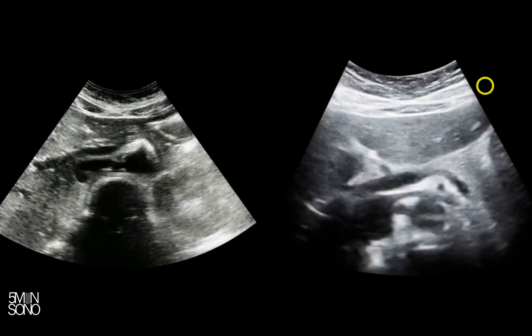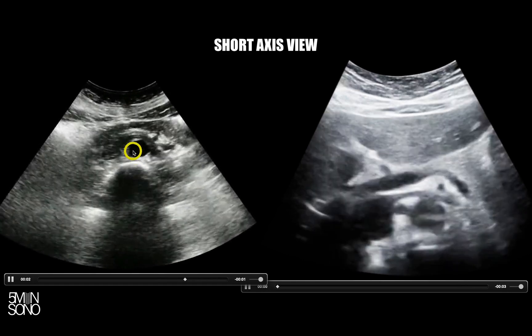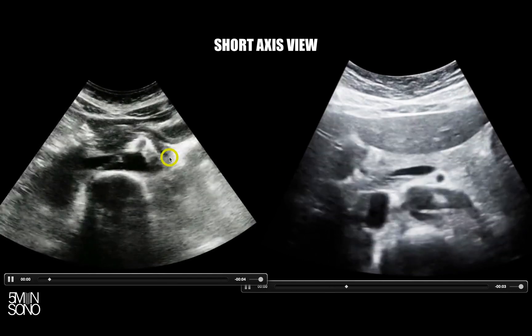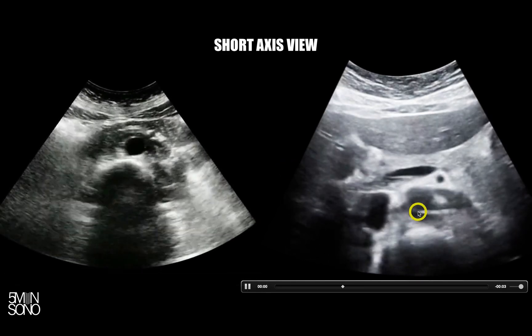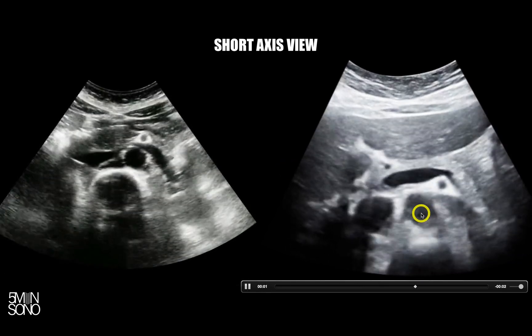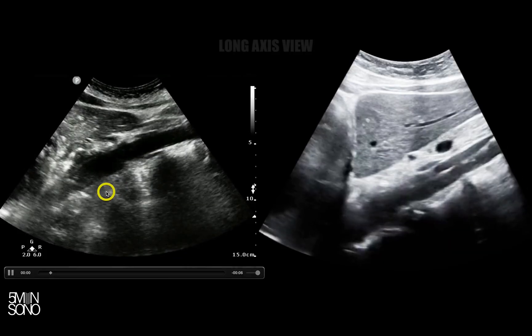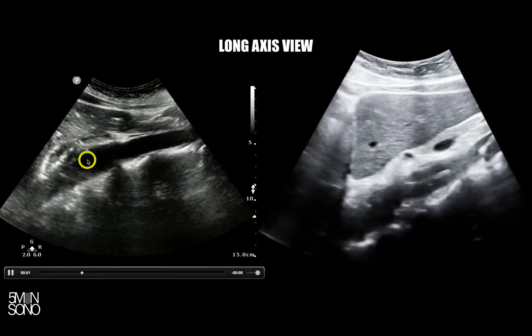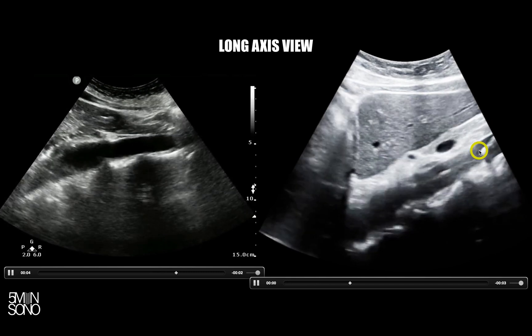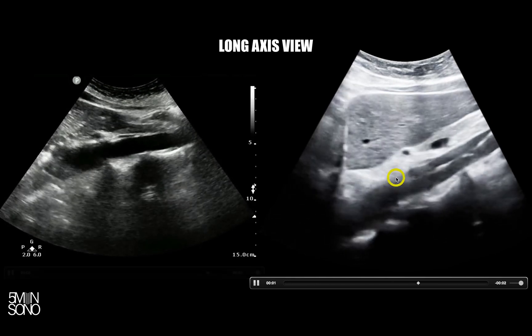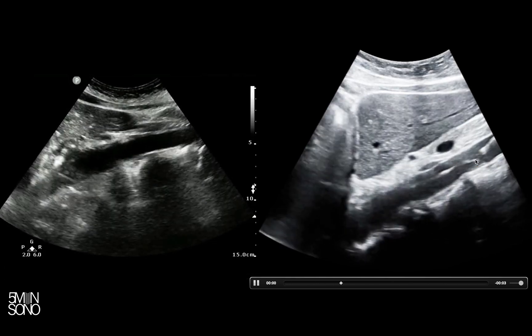Now let's compare that with this. In a normal aorta there's no flappy thing inside, but here I see a flap — a flappy thing inside this aorta. This is abnormal; this is what a dissection looks like. Over here we have an aorta without a dissection in the long axis, and here you can easily see this stringy thing inside the aorta. This is what a dissection looks like.